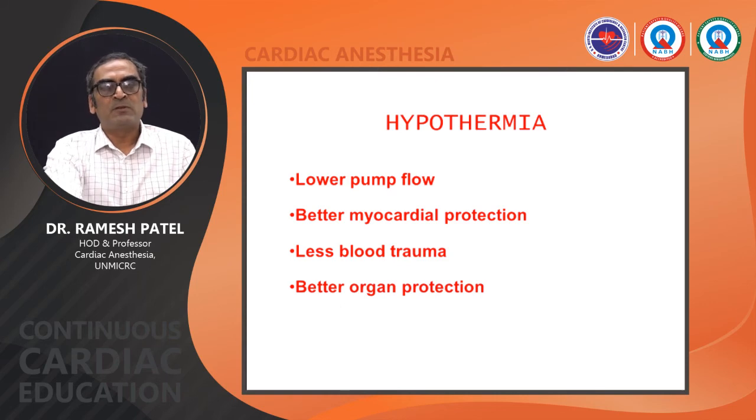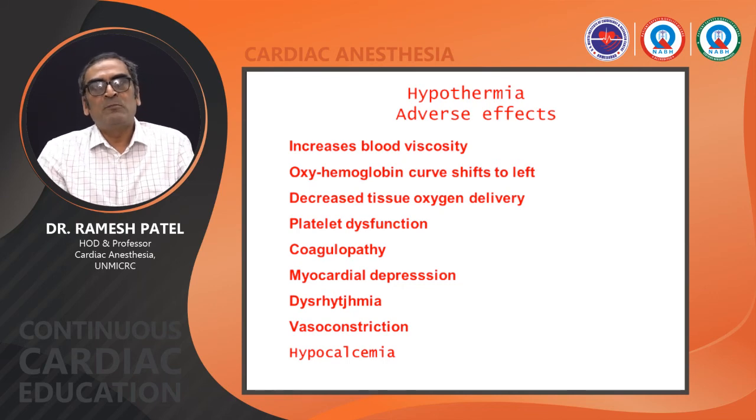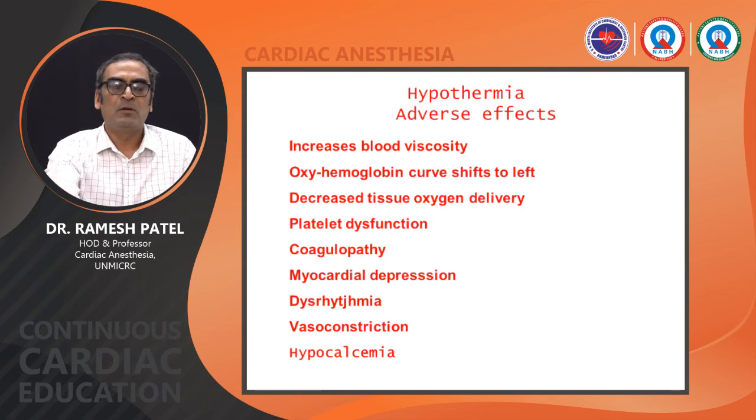These are the benefits of hypothermia: it will lower pump flow, so better myocardial protection, less blood trauma, and better organ protection. But hypothermia also has some adverse effects, like it will increase blood viscosity, and it will shift the oxyhemoglobin curve to the left, so oxygen delivery will be less. And of course, platelet dysfunction, coagulopathy, myocardial depression, dysrhythmia, vasoconstriction, and hypocalcemia. These are the side effects of hypothermia, so we must take care of all these problems.